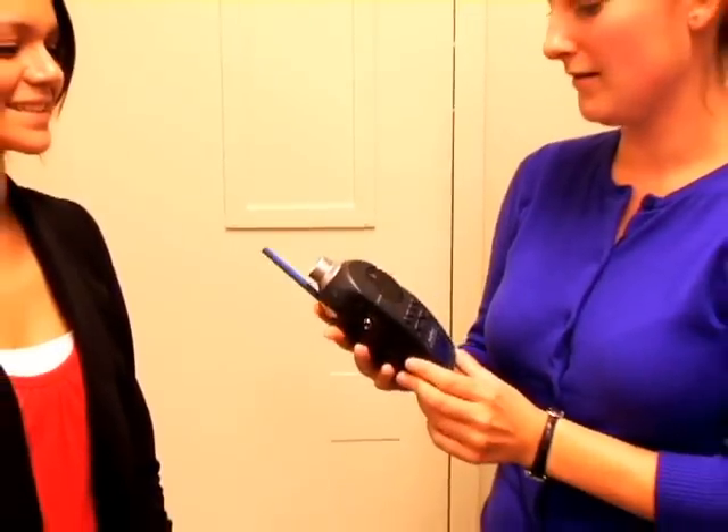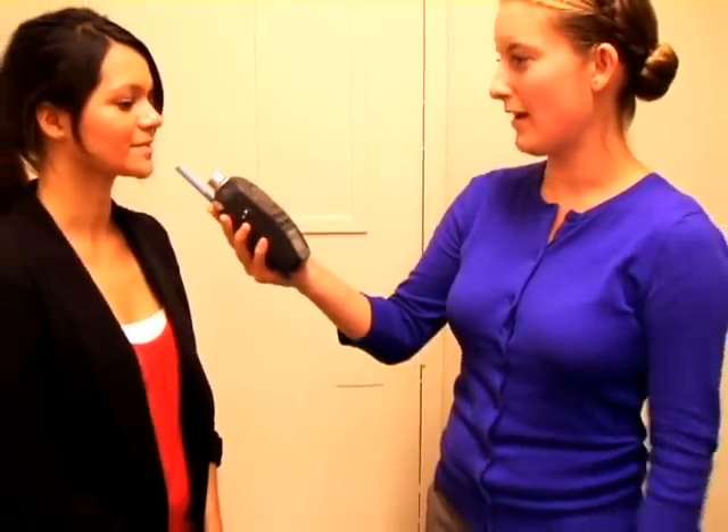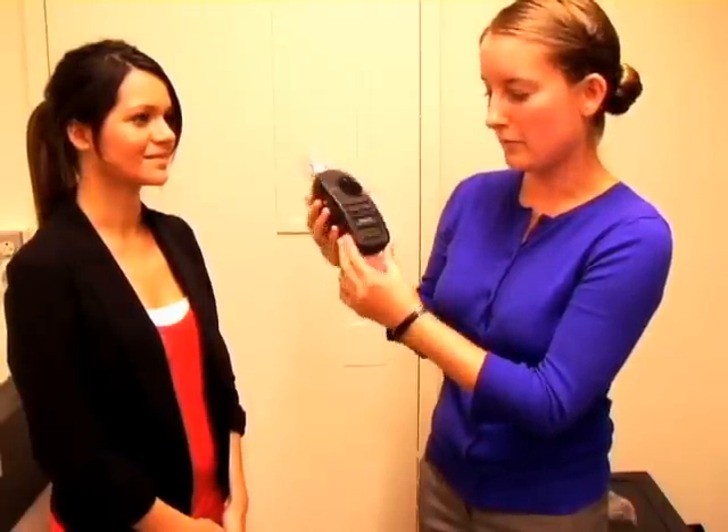So now I am going to hold the SPL meter up to the mouth and she will sustain the vowel AH for 3 to 4 seconds. AH. And the sound level meter read 90 decibels. And that is how we use the sound pressure level meter.